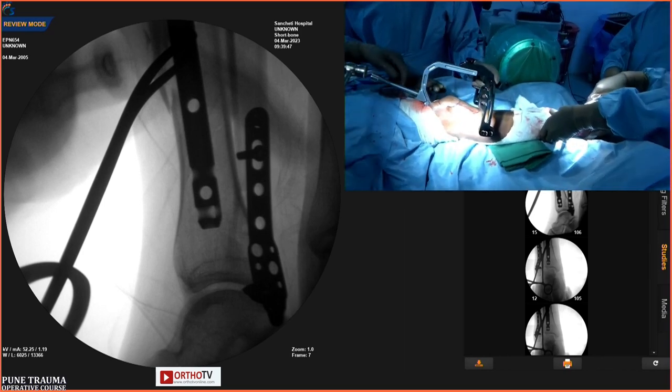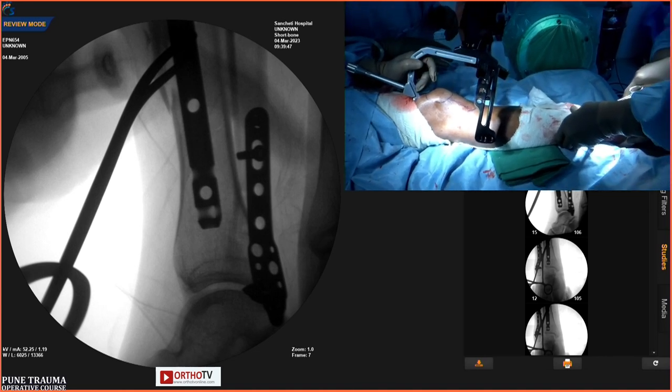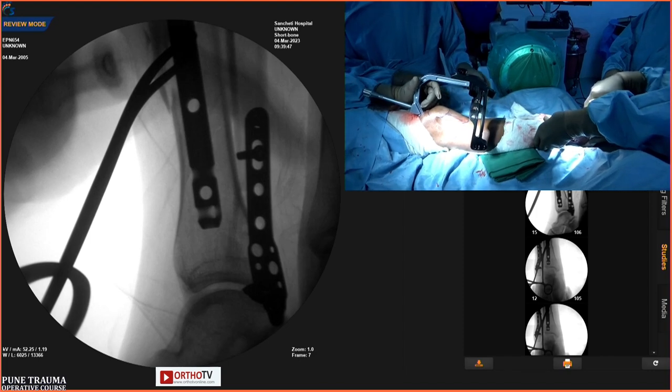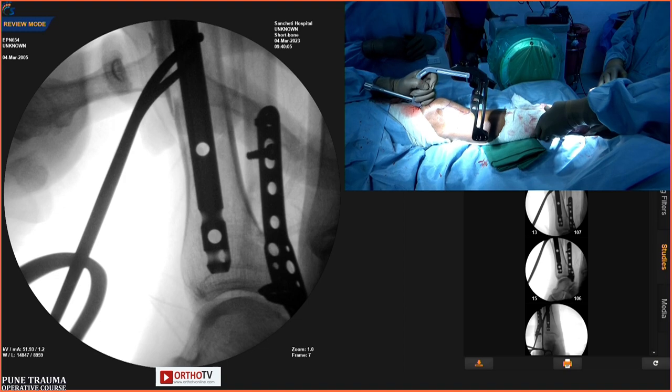Dr. Gadegone. Yes, sir. Your fibula is not anatomically reduced. If you can see the... Yes, yes, we will. Shoot. Right. You can see here. Yes, now, sir. Now it's better.